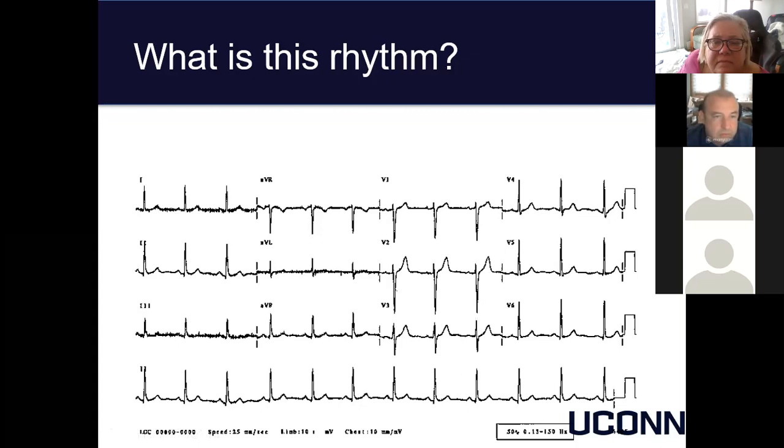Normal sinus rhythm, probably. Normal, yep. I mean, the P waves are difficult to discern, but if you look at the rhythm strip, it's a little bit easier to see the P waves. But yep.